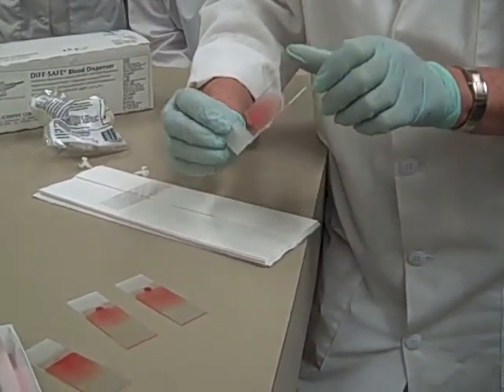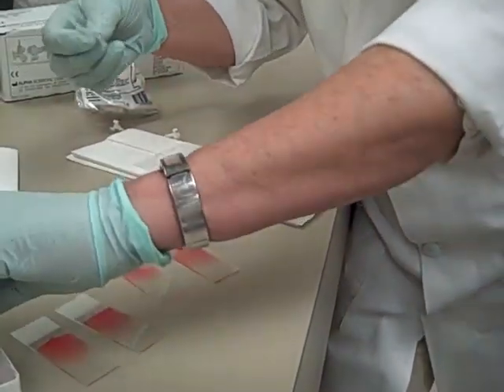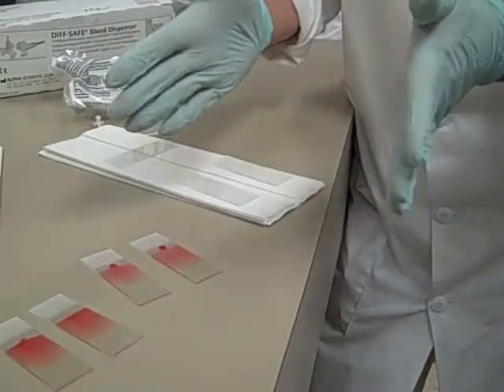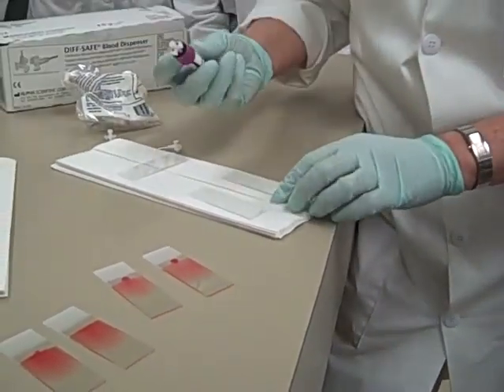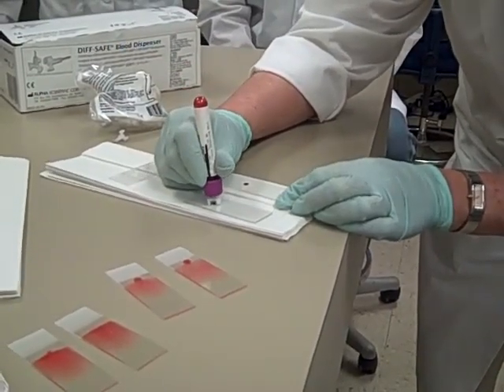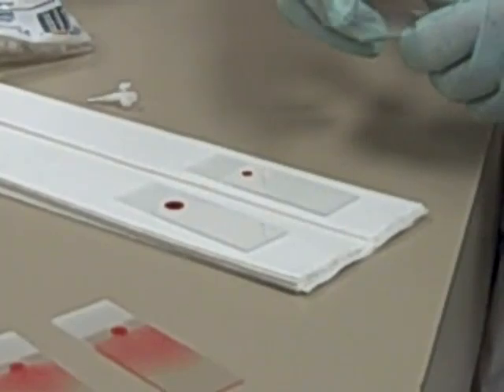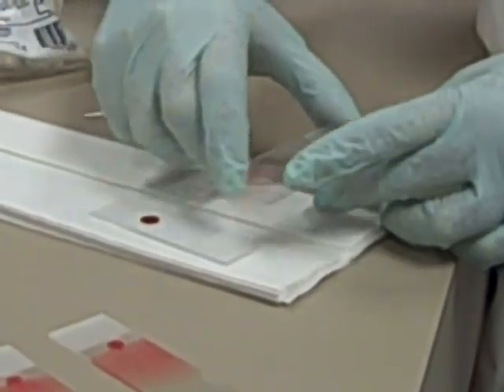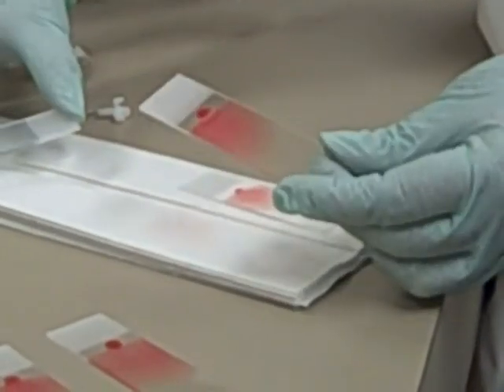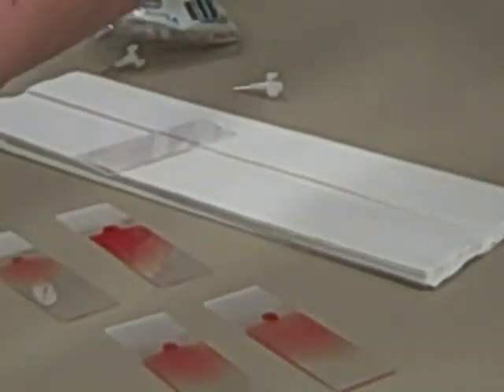I can change how long the slide is and how thick it is by doing a couple of things. There are three ways to affect the length of the smear. The first one is pretty obvious: a tiny little drop of blood gives you a short little slide, while a bigger drop of blood gives you a bigger, longer slide. You want to hit about midway. So the size of the drop of blood will affect the smear.